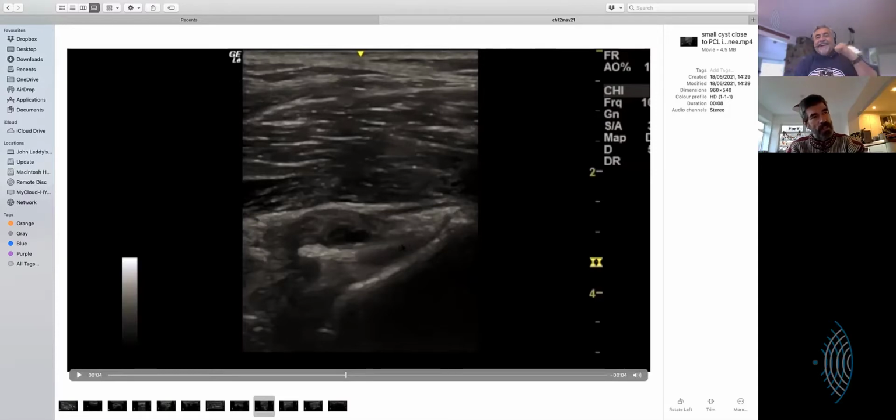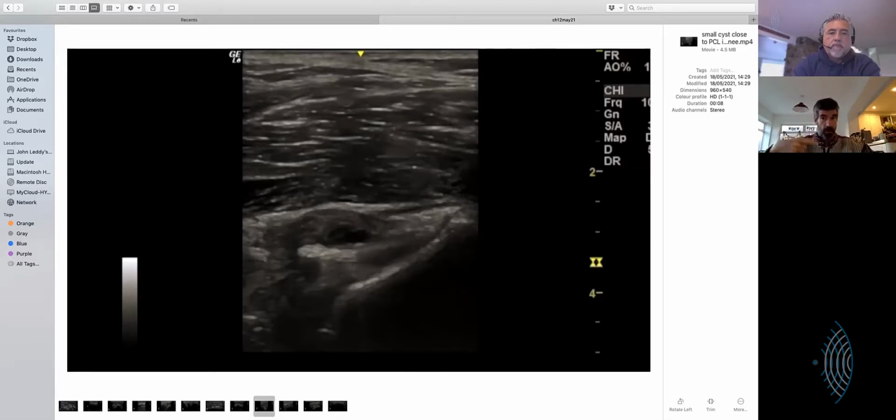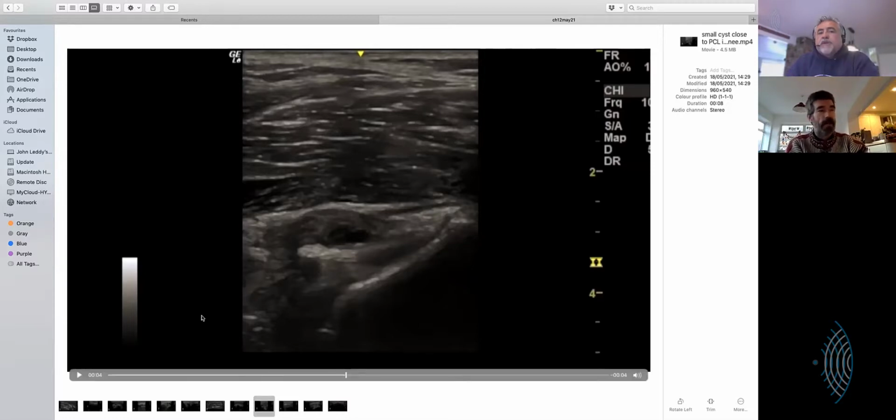What you do is you see it go up and then disappear, and that's normal, because it's going up and winding around the ACL probably, and so you don't see a tendon going all the way through. On a nice example, on a very young person, you can actually catch it in short axis and follow it up in short axis, and then you sometimes can actually see a shadow of it attaching onto the inside of the condyle. I can't even remember which way it goes now. But yeah, that's not a diagnostic test. That's just a fun thing to do.